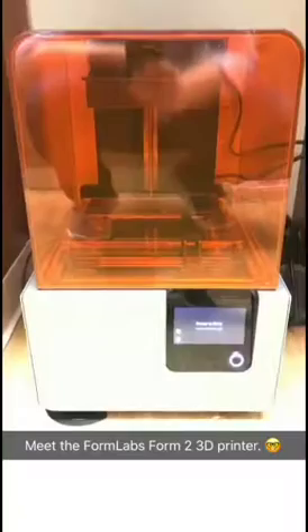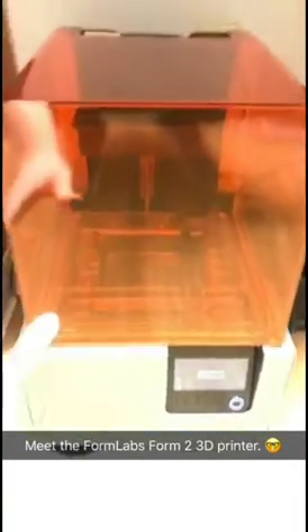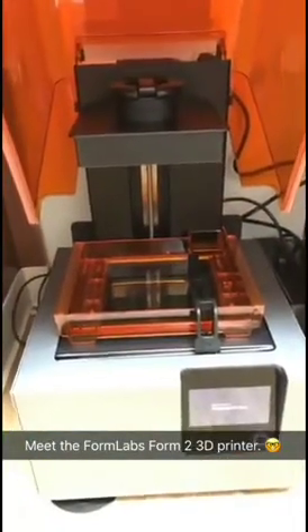This is our setup. These are my teeth, and I'm about to print them. This is our printer — a Formlabs Form 2. You can use it for a lot of things like action figures or chess sets, but also obviously for teeth.